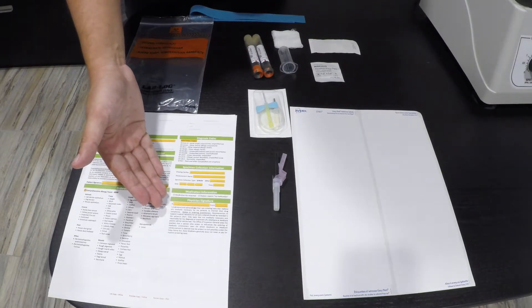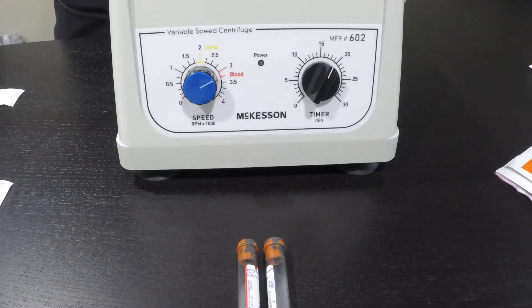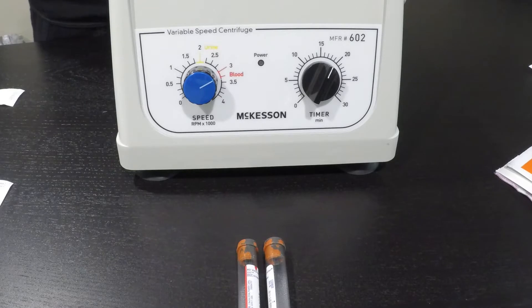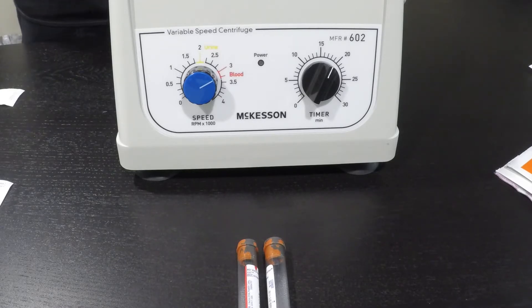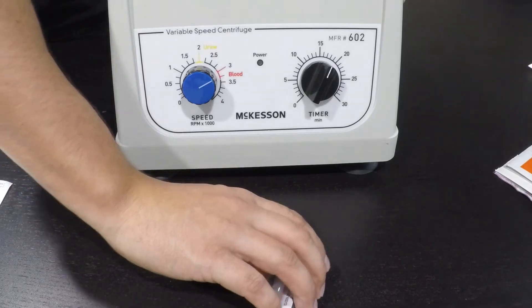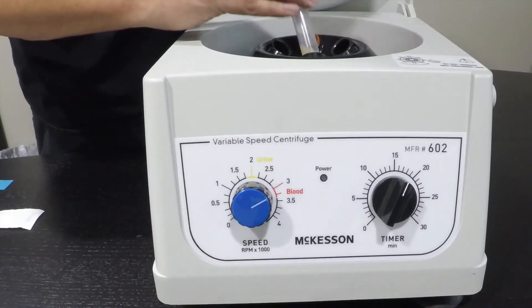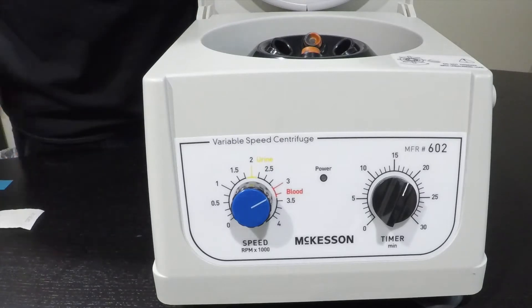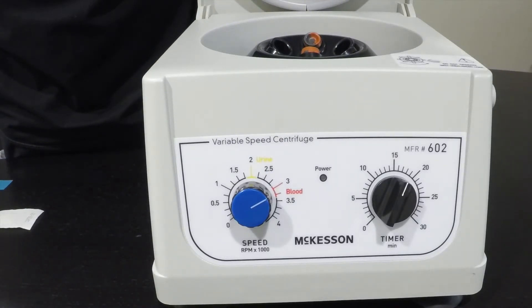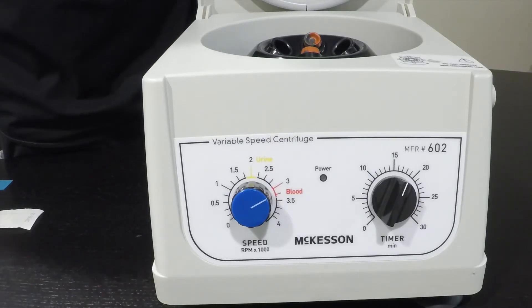We will also need the provider's signature and date. The MA must let the blood sit for 10 to 15 minutes or until clotted. Once clotted, the MA will place the blood into the centrifuge, set at 3,300 to 3,500 RPMs, and spin for 15 to 20 minutes.